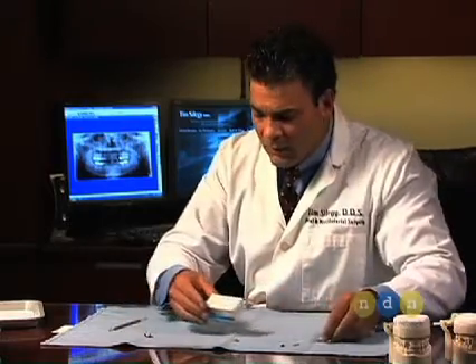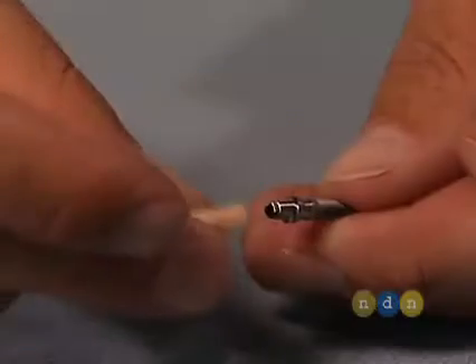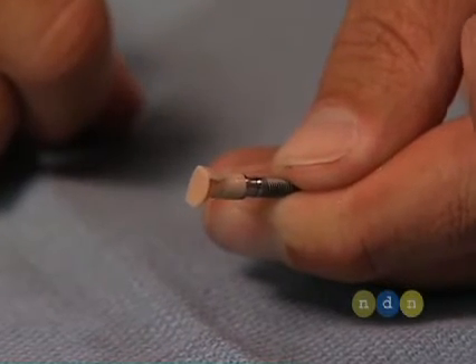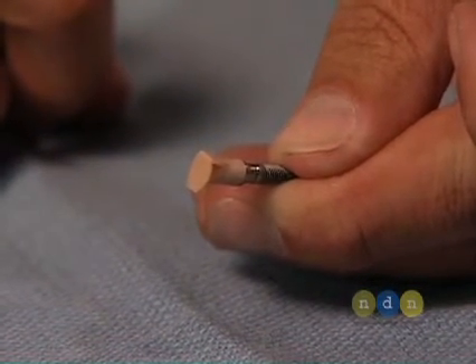Perhaps the greatest advantage of using the HexLock Contour Abutment is the development of a very easy-to-use impression coping analog system. This comes as a prefabricated kit containing an analog, two copings, and a snap cap impression post. The snap cap impression post fits easily over the top of the abutment, and a traditional crown and bridge impression can then be made.